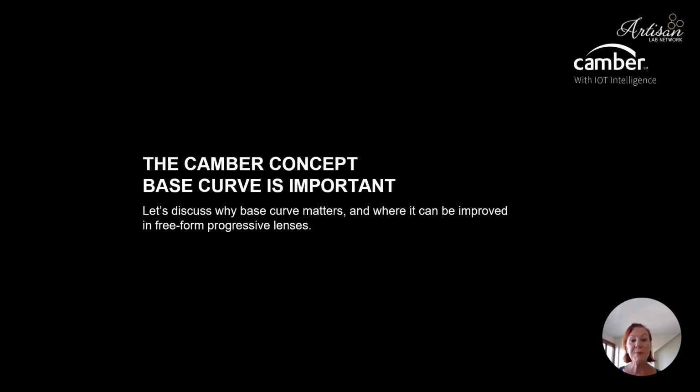The Camber concept is that base curve is important. Base curves matter. For every prescription, there is a perfect base curve. Years ago, we talked about this with corrected curve theory and even may have studied Vogel's formula.